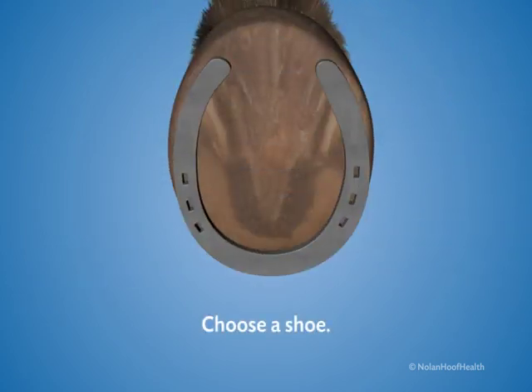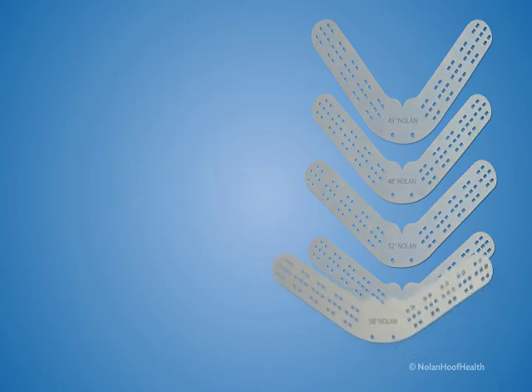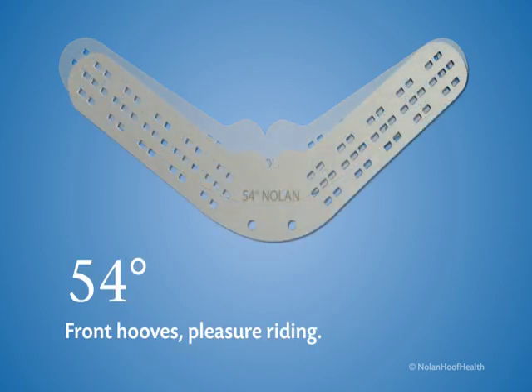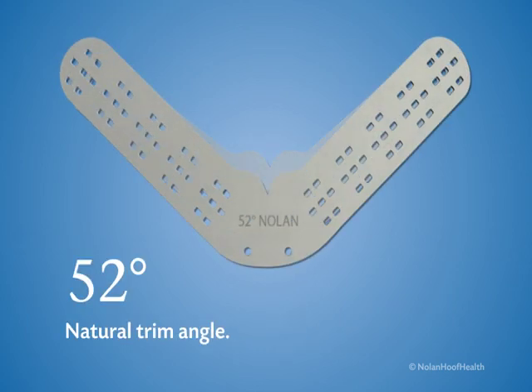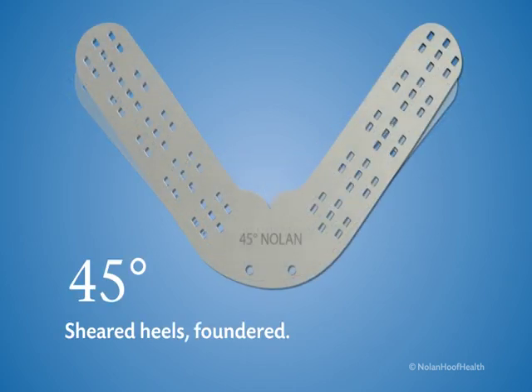Choose a shoe. The Nolan hoof plate comes in five angles: 56 degree, often used for navicular syndrome or gaited horses; 54 degree, most common for front hooves and pleasure riding horses; 52 degree, commonly used with a natural trim angle; 48 degree, for sheared heels or foundered horses; and 45 degree, for sheared heels or foundered.